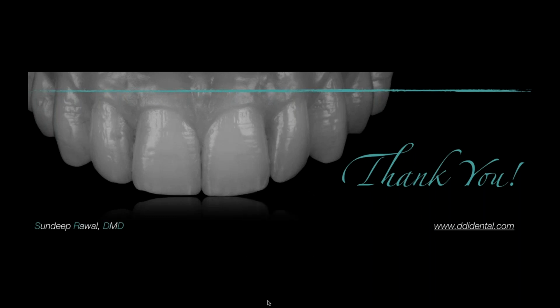Sundeep. Very insightful. Our first question is, would you say robotics can help to properly place implants? Yes. In dentistry today, we have three main mechanisms of performing guided implant placement. The conventional thinking was that guided means you print a resin guide.